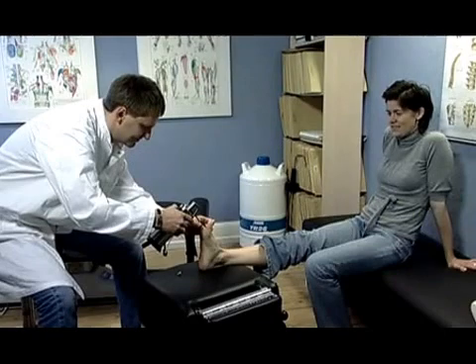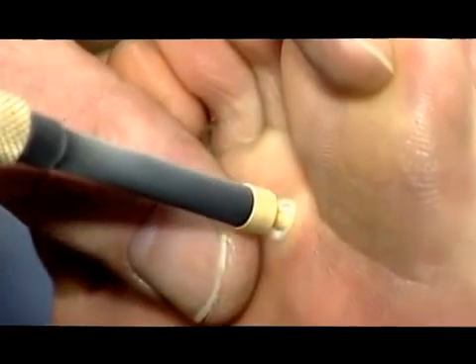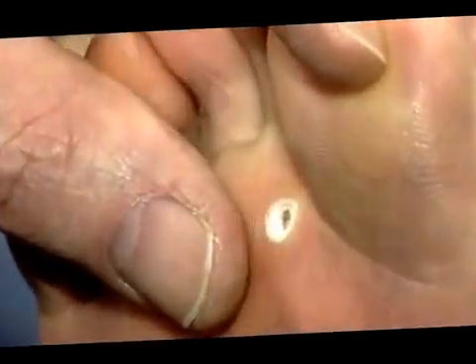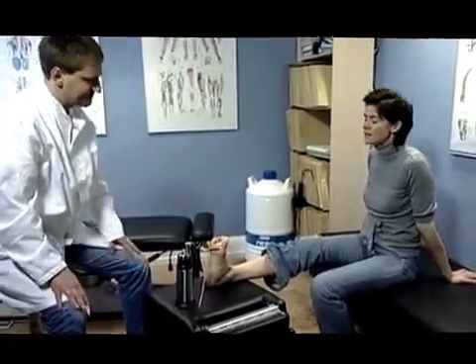This method ensures the quick freeze, slow thaw, leading to optimal tissue destruction. Contact freezing offers a deep freeze with minimal lateral spreading. The freezing time depends on the type of lesion as well as the operator's personal preferences.